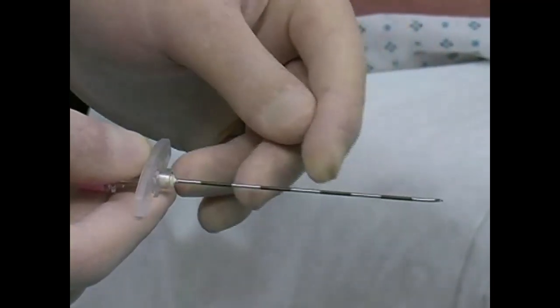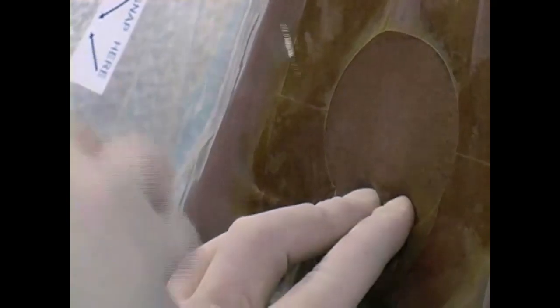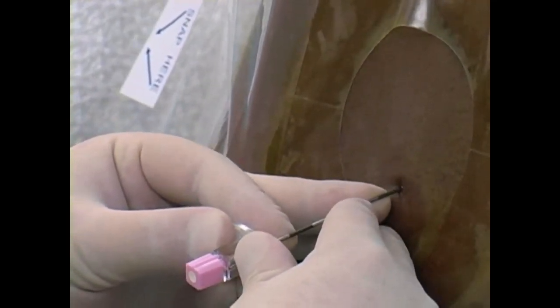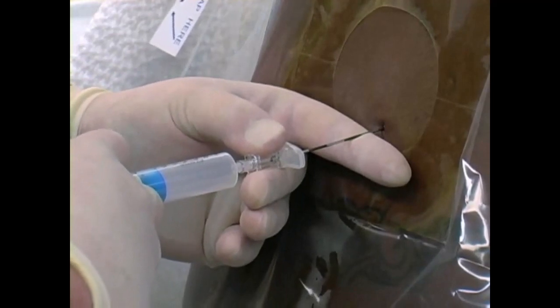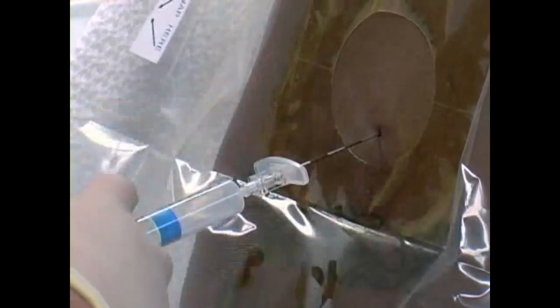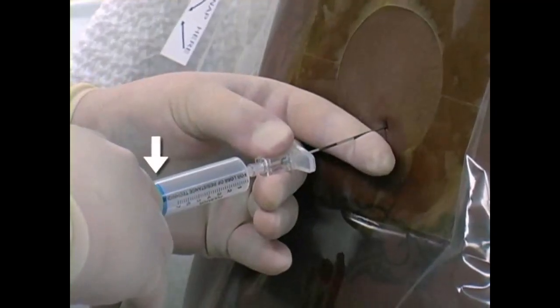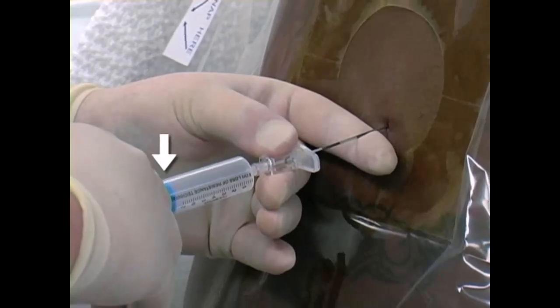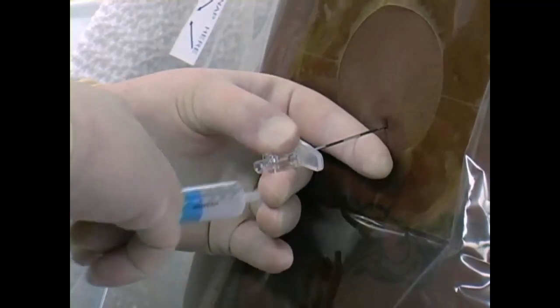Identify the Tuohy needle. Count the 1 cm markings on the needle barrel to determine its length. Insert the Tuohy needle at a slightly superior angle into the intervertebral space previously established by the finder needle. Grasp the hub of the needle to control the rate of needle insertion. Direct the Tuohy needle until the tip encounters the tough tissue of the interspinous ligament. Hold the hub of the needle and remove the stylet. Fill the loss-of-resistance syringe with 4 cubic centimeters of air or saline and connect it to the hub of the Tuohy needle. Grip the needle between the index finger and thumb of your non-dominant hand and secure your hand against the patient's back. With the thumb, gently tap on the plunger, feeling for loss of resistance. Insert the needle no more than 2 millimeters at a time until loss of resistance is achieved. Easy injection of the air indicates that the needle is in the epidural space.